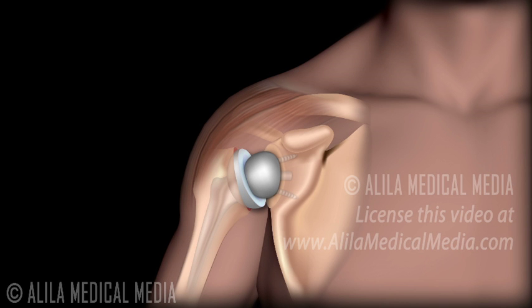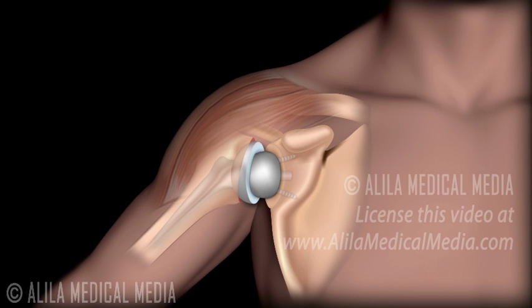Why would a reverse total shoulder work? In the reverse total shoulder procedure, the arthritic humeral head is replaced with a plastic cup and the metal ball is fixed onto the glenoid surface. With this configuration, the contraction of the deltoid will move the arm up and compress the socket to the ball at the same time. The ball and socket will fit more snugly together, providing stability.